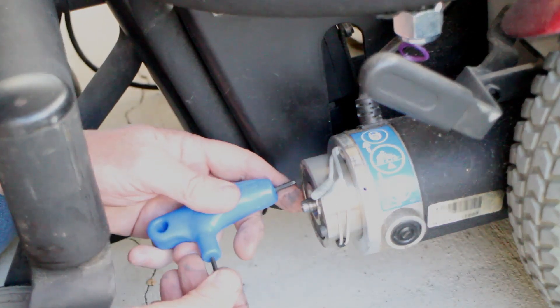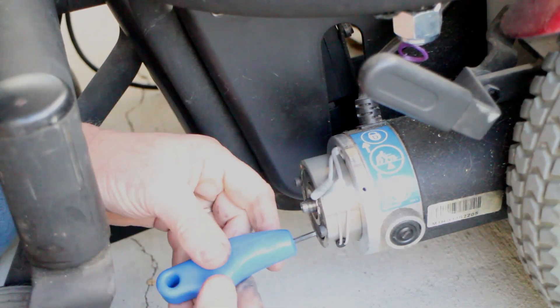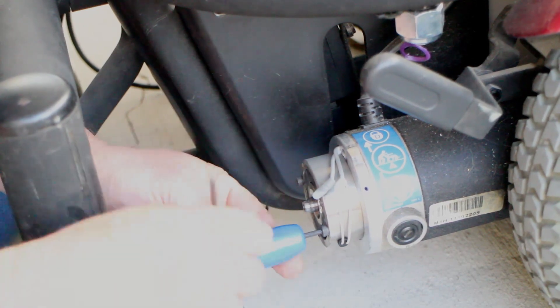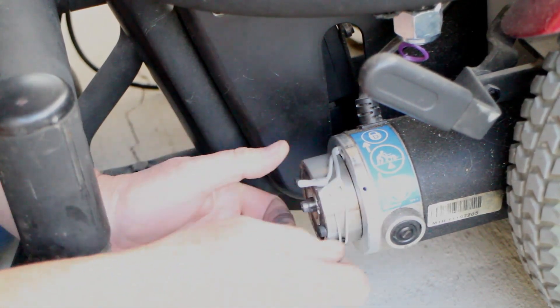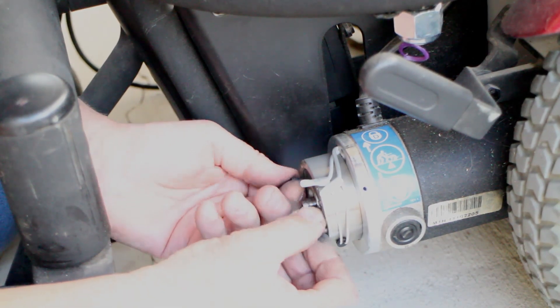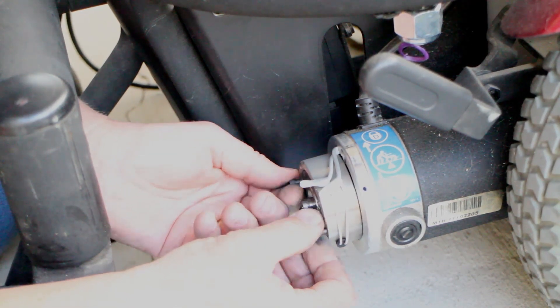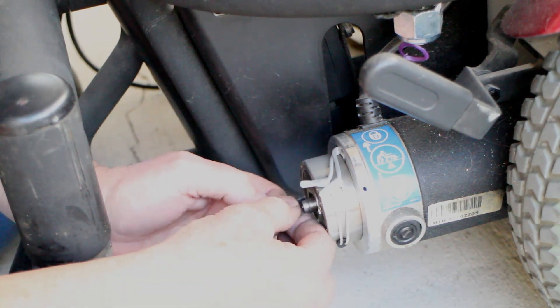Next, using the three millimeter hex wrench, remove the two screws on the side of the magnet. This allows the magnet to slide right off of the shaft.